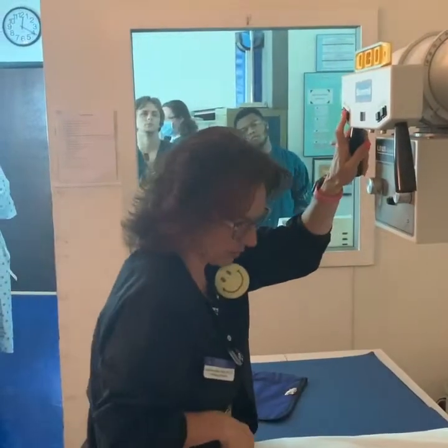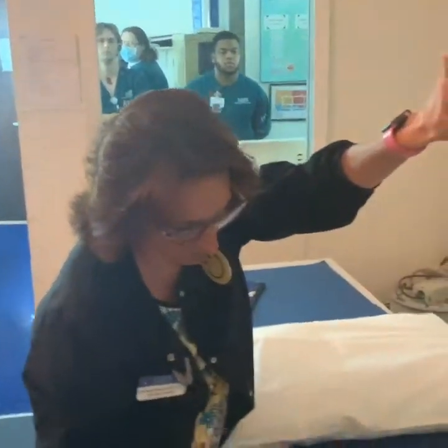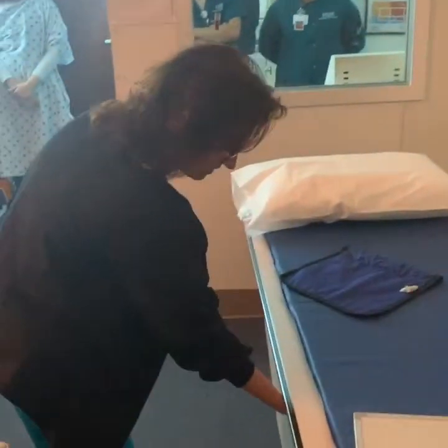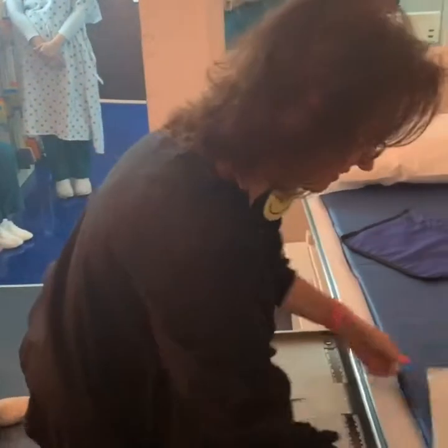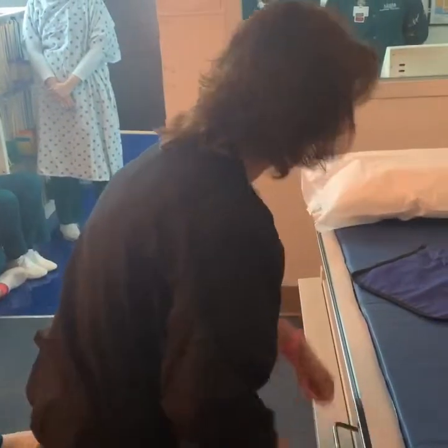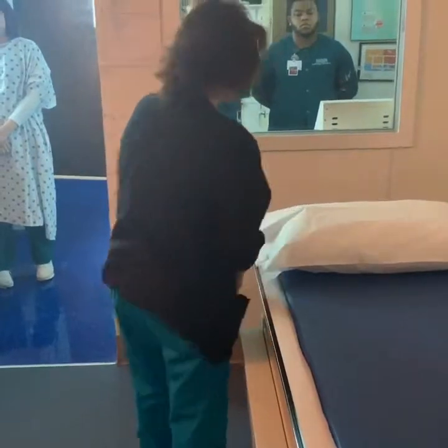Like I said, we're in the bucky because the part is greater than 10 centimeters. And we're above 60 kVp, so we're going to be in the table bucky. And usually the biggest thing with this that you want to try and do is get the femur that's affected in the center of the table if you can, so that you're not having to move the patient all over the place. We'll shield on the distal views, but probably not shield on the proximal views because she's a female.